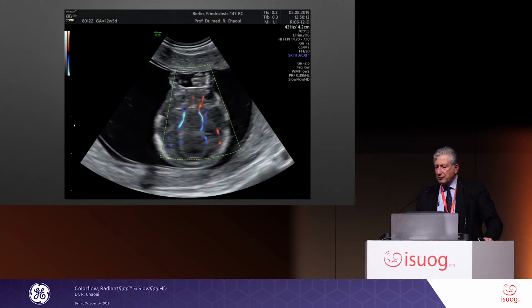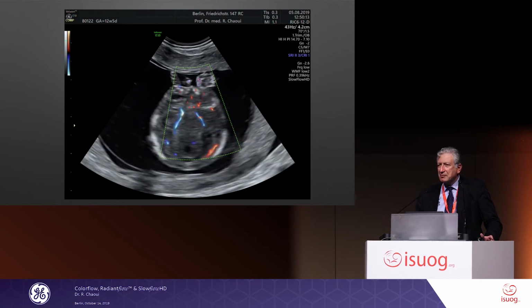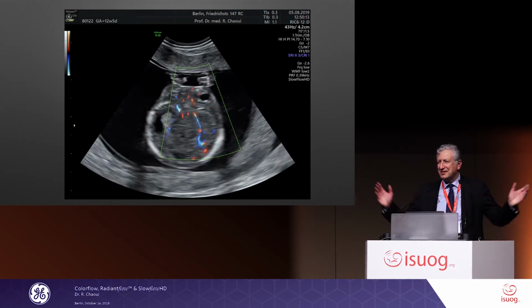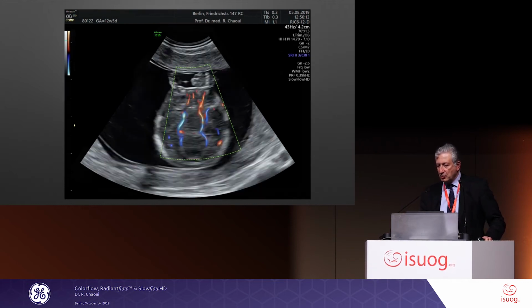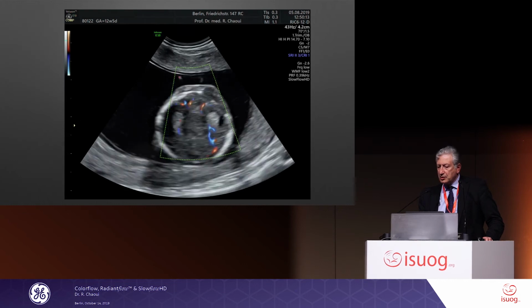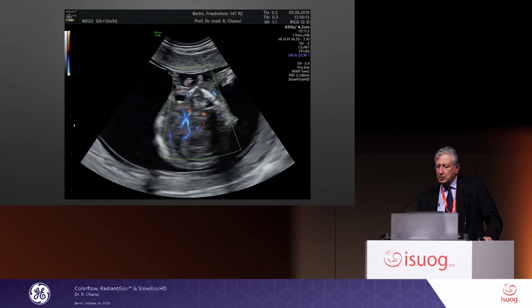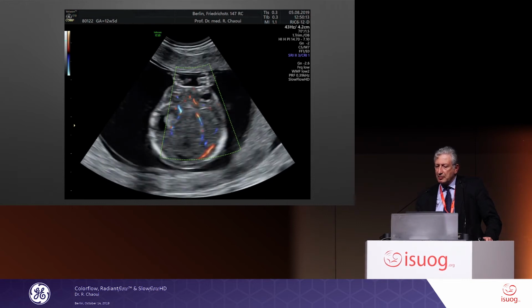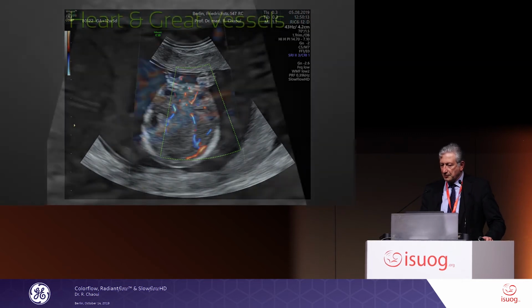And you see, this is a fetus with holoprosencephaly, and accidentally, we did the same at the same time in two different cities, in Osaka and Berlin. So you see here the vessels, what you were telling us this morning, are exactly the same you could demonstrate. So you see here the close artery toward the nose because of the hypotelorism, and abnormal shape because probably this lens will not work.